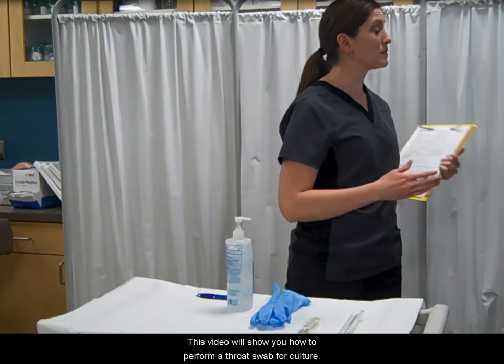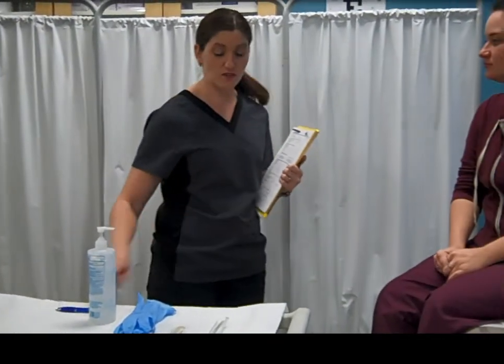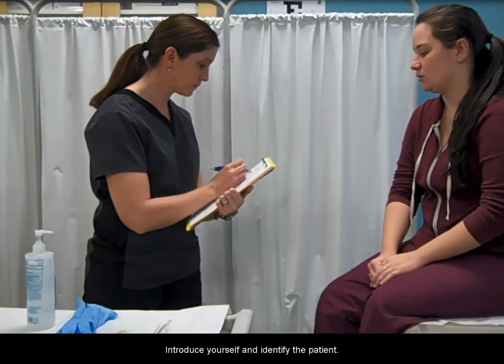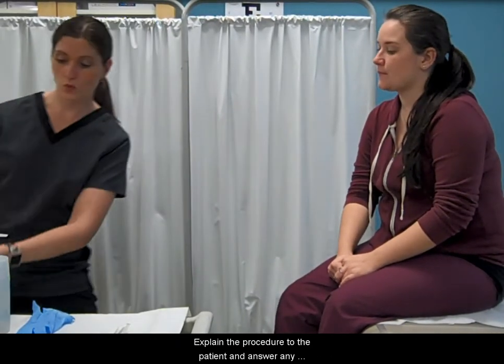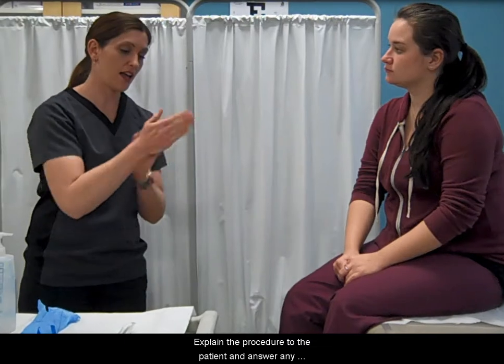This video will show you how to perform a throat swab for culture. Introduce yourself and identify the patient. Explain the procedure to the patient and answer any questions.